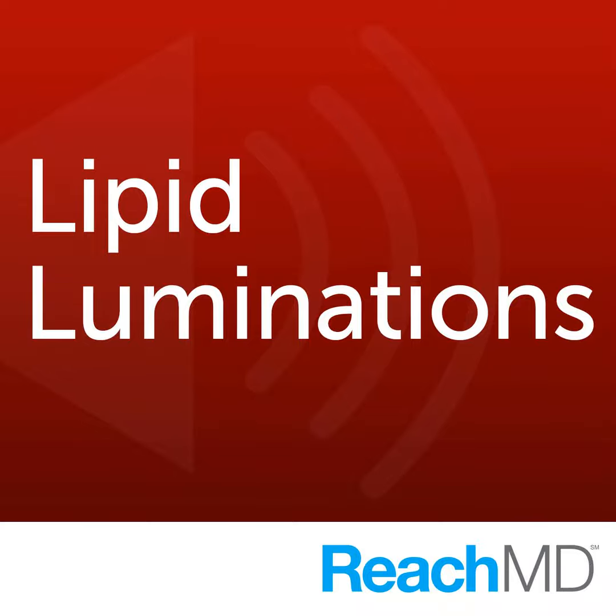And clearly that's another of the areas of controversy with carotid IMT: standardization of the technique. And there clearly is some observer or operator importance to the test. So when you're a physician looking for a lab to do carotid IMT, I would say look for accreditation, look for experience, look for the director of the lab as being someone who has passion about evaluation of coronary risk factors and is a preventive cardiologist, all the things that people like myself and James Stein bring to their labs to bring, if you will, accuracy and reproducibility to the measurement.